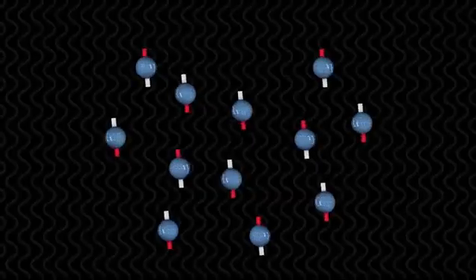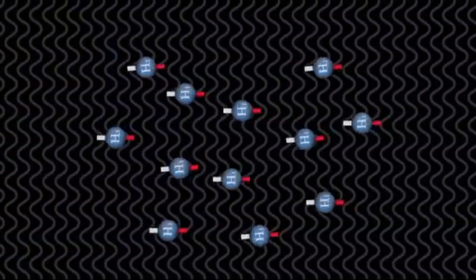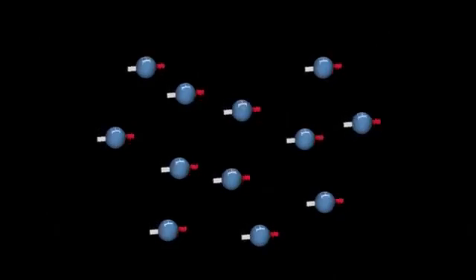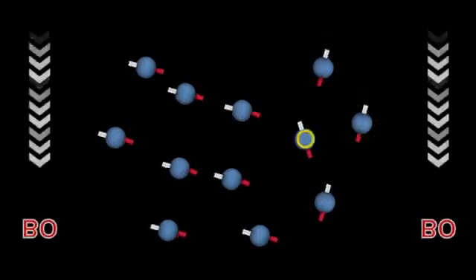When a radio frequency pulse with the same frequency as the proton's precessional frequency is turned on, the up protons flip away from the B0 field, as they absorb the RF energy. When the radio frequency pulse is turned off, the protons flip back and realign along the main magnetic field, B0. As the protons flip back and realign with B0, they give off energy.